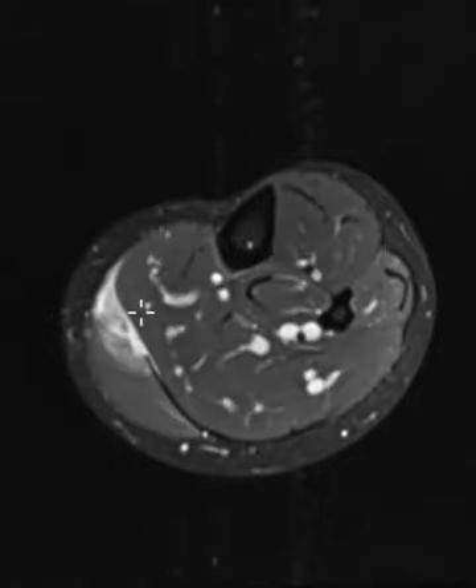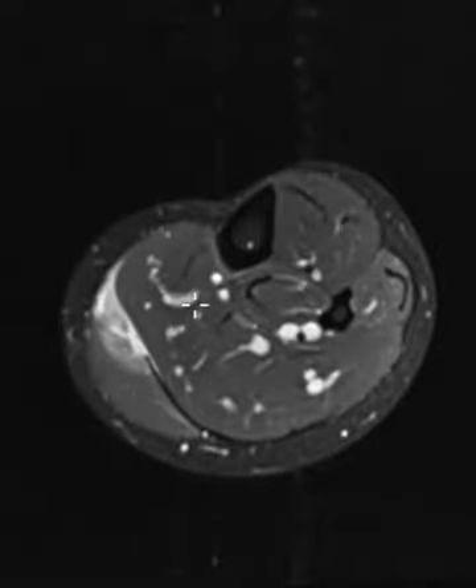So the lateral gastroc is over here, looks good, but the medial gastroc looks like it's partially torn and stripped right off the underlying fascia, peeled away from this underlying soleus muscle. These two muscles go down to form the Achilles, but you can see this little piece here of central tendon and thick fascia is discontinuous, and this is the hemorrhage.